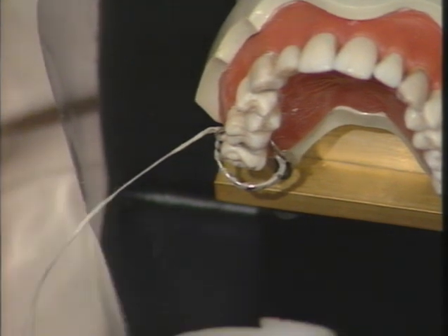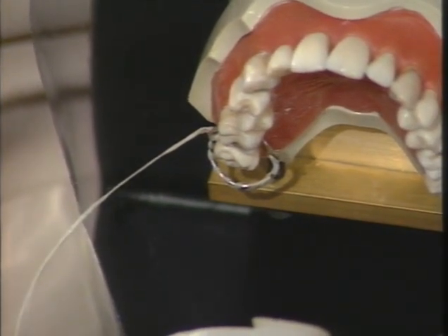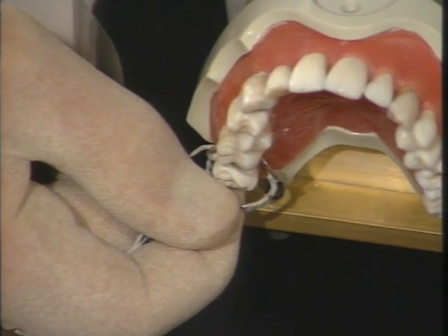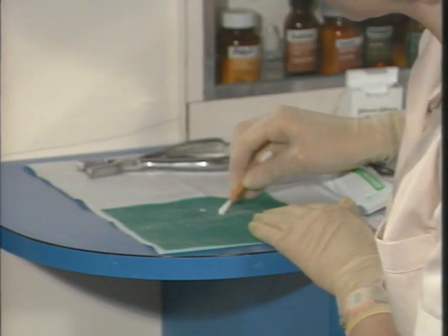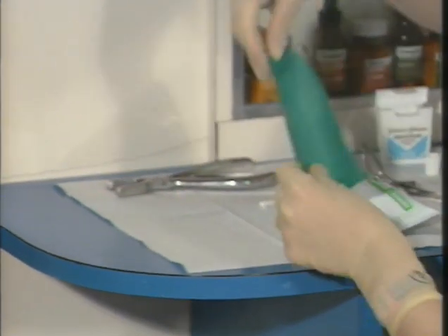In doing it in this way, I've got control over the clamp in all its movements, and also the gingival tissues don't tend to be trapped. When it's in position, I simply have to test it just to make sure that it is secure. Chris is now going to lubricate the dam for me so that I can then place it over the clamp and around the teeth. That's fine.